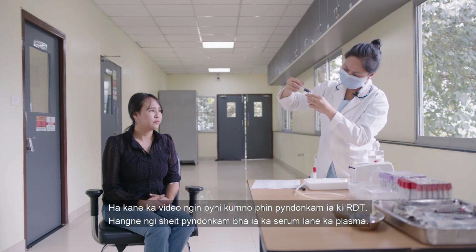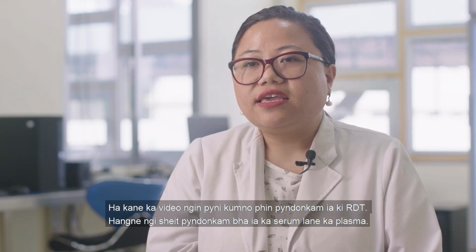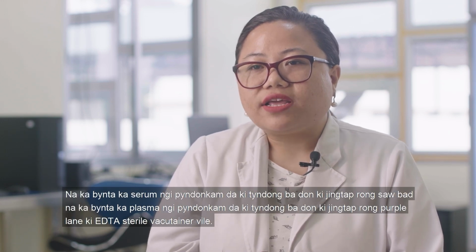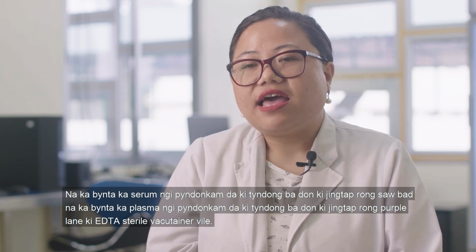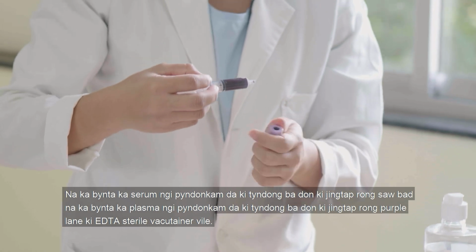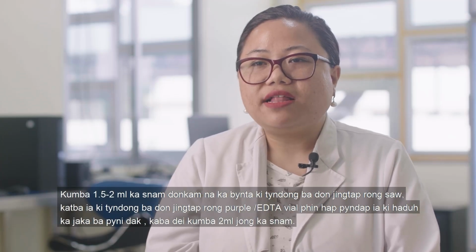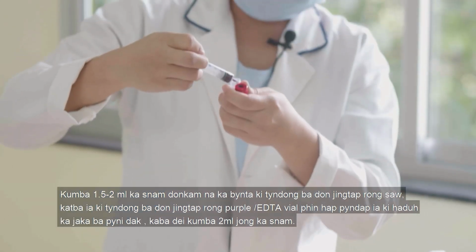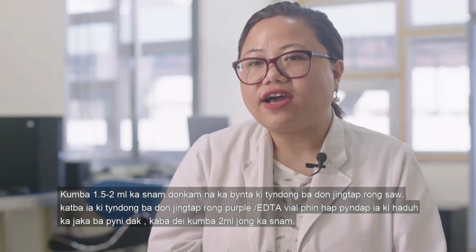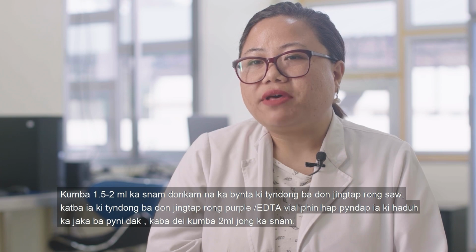In this video, since we are going to be showing a tutorial for how to use RDTs, here we mostly use either serum or plasma. For serum, you use a red capped Vacutainer sterile vial, and for plasma, you can use a purple capped or an EDTA sterile Vacutainer vial. At least 1.5 to 2 ml of blood is required for a red capped vial, whereas for a purple colored EDTA vial, you are going to fill the vial up to the marked area in the vial, which is most commonly up to 2 ml of blood.